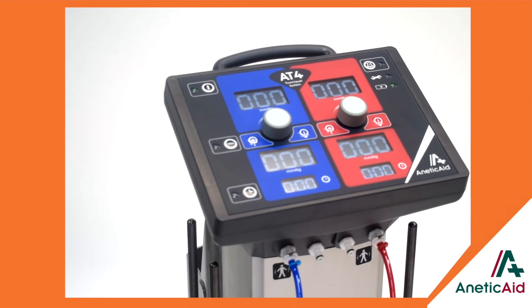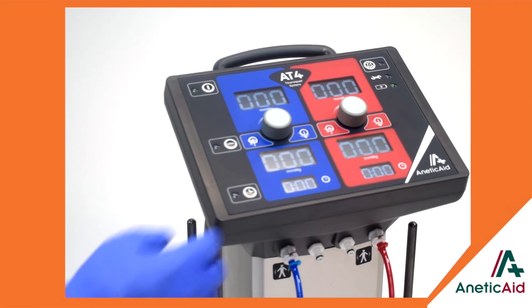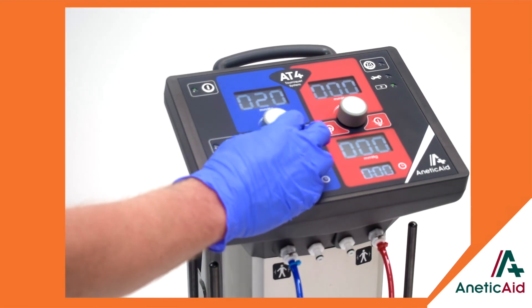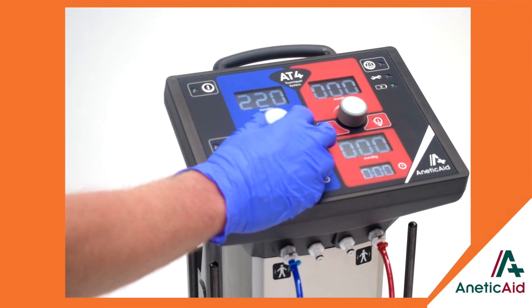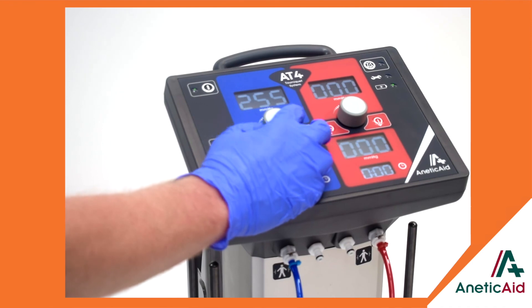Finally, we have our innovative intravenous regional anaesthesia guidance feature, which only allows you to use the AT4 in a particular sequence, helping to improve safety even further.